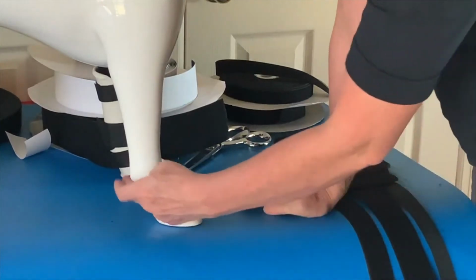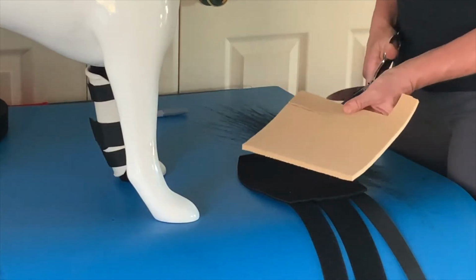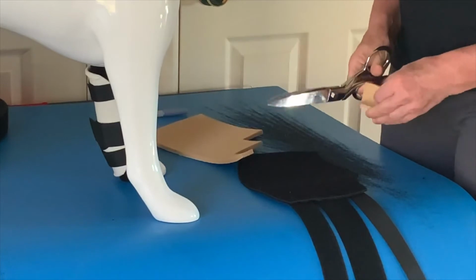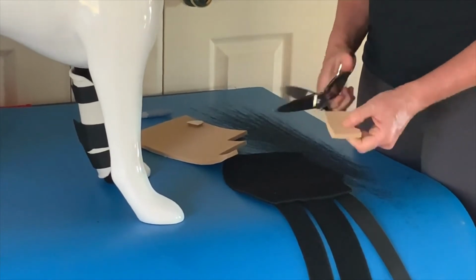Since most dogs have a normal carpal angle that is in slight extension, it's important to occupy the space under the accessory carpal pad. This will help to support the carpus and make for a better fitting brace. Shape your padding so that it fits intimately under the accessory carpal pad.